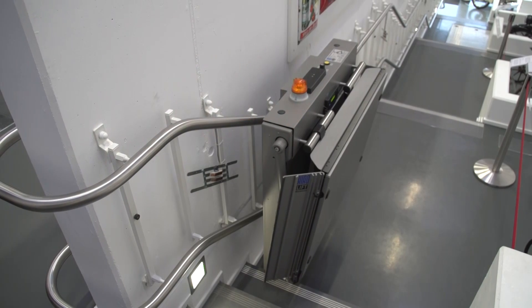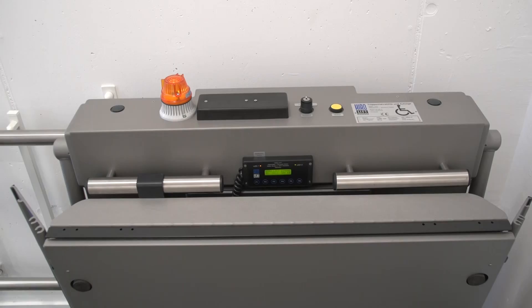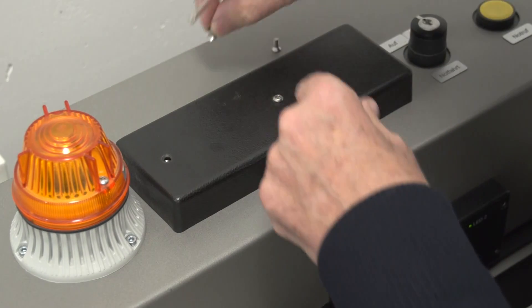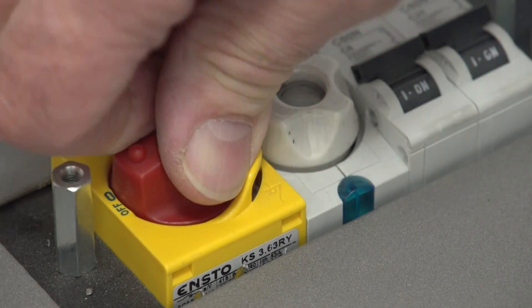You can leave the lift at the intermediate stop or, if desired, move it upstairs or downstairs. If the system is not needed for extended periods — for example, while on vacation — the main switch should be turned off.